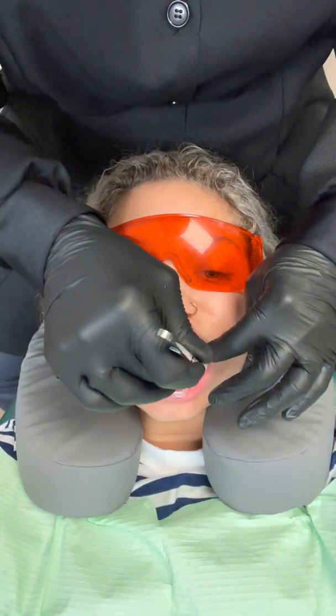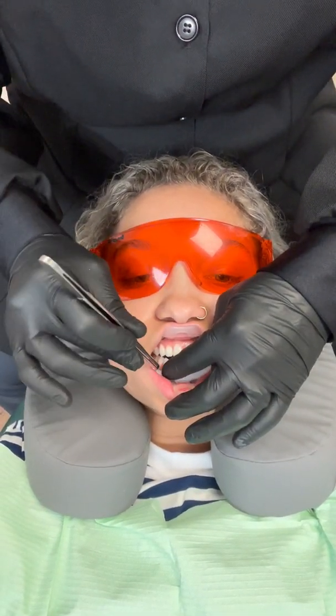We're going to be doing some in-office whitening on Haley. I've just taken a little two-by-two and I'm going to stick it down here in the vestibule area just like that. We're utilizing the umbrella retractor from Ultradent, and now I'm going to put one in the top as well.